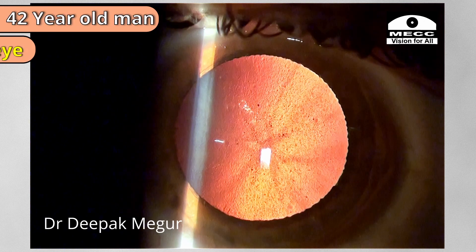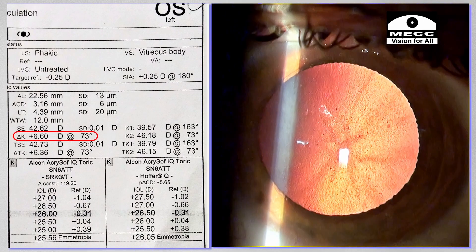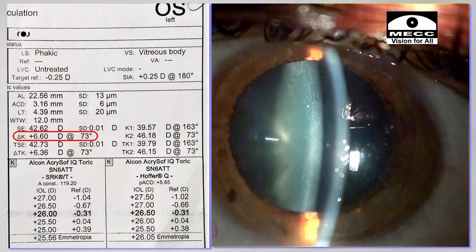This is a 42-year-old patient with six and a half diopters of pre-existing astigmatism, posted for surgery.